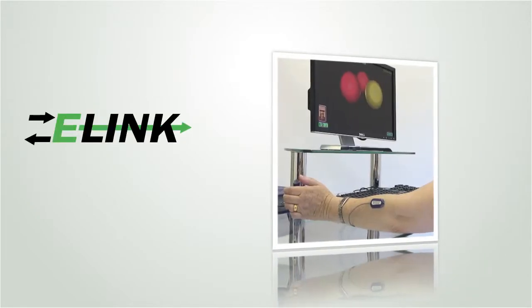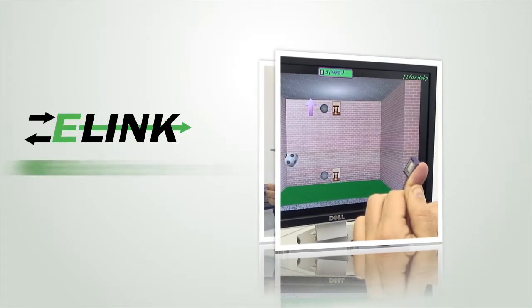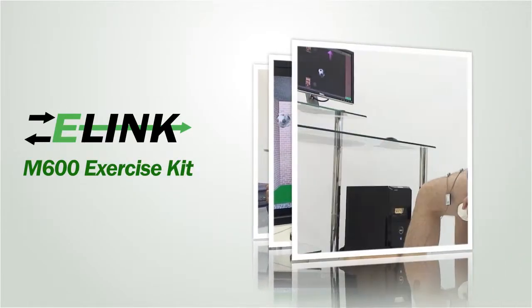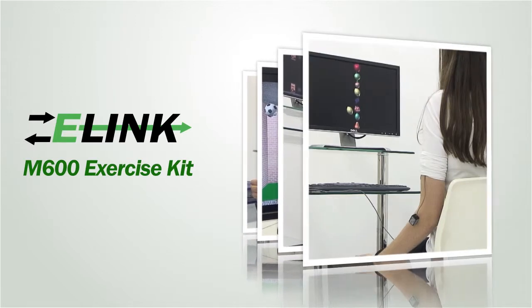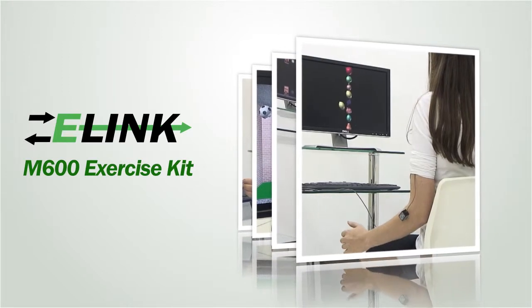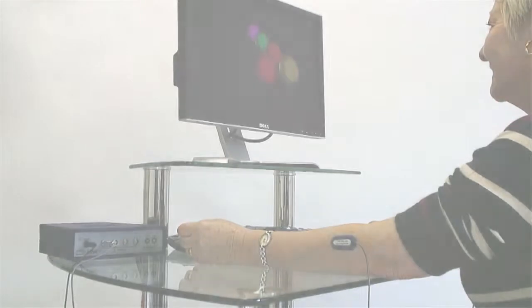The M600 exercise kit is an exciting module of the e-Link system, using the unique MyoX and AngleX sensors for inspiring computer-based exercise.